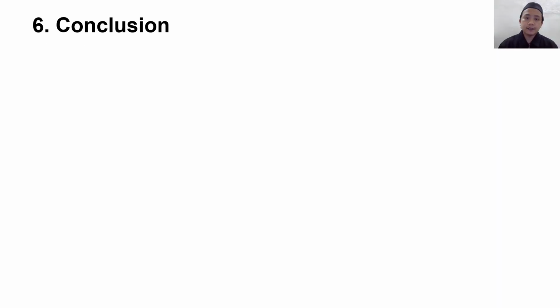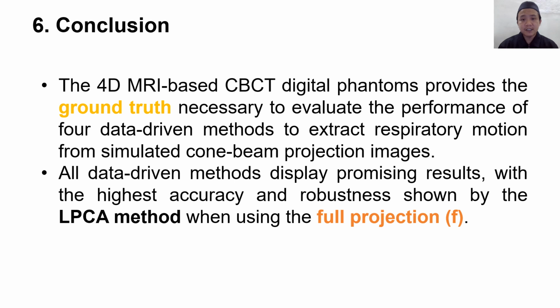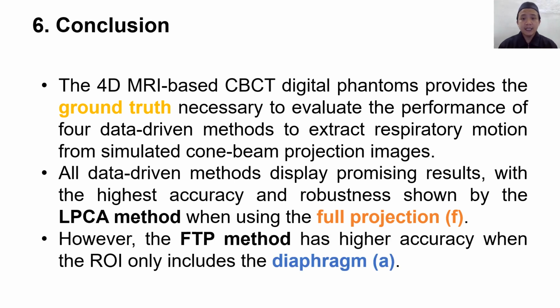As a conclusion, this study showed how a digital phantom using 4D MRI data provided the necessary ground truth to evaluate the performance of the data-driven methods. The results indicated that these methods displayed promising results, highlighting the robust potential of the LPCA method when using the entire full projection image. And lastly, even though the FTP method showed the highest correlation value compared to the other methods, this only applies when the ROI selected only contains the diaphragm.